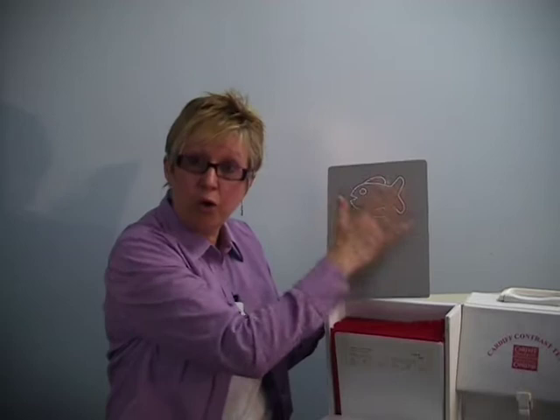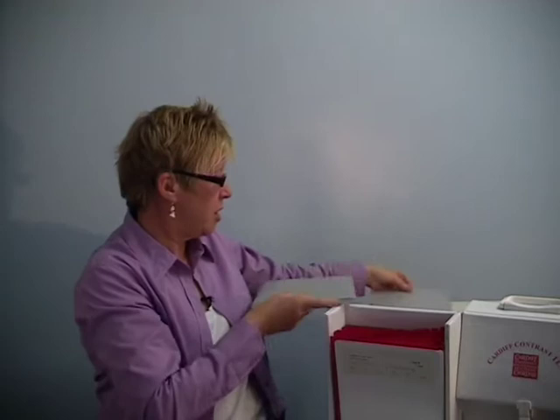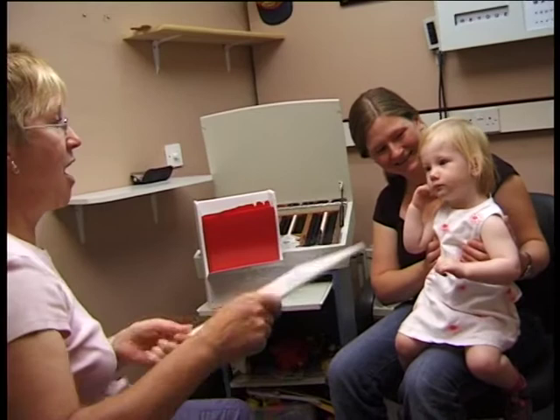This means if the patient can't see the outline, the whole card looks blank. As we proceed through the test, the pictures get finer and finer in outline, so that eventually when a picture is beyond the acuity of our patient, there's simply nothing to see. The whole card looks blank, and the patient can't look at the picture — that tells us we've moved beyond the patient's acuity limit.